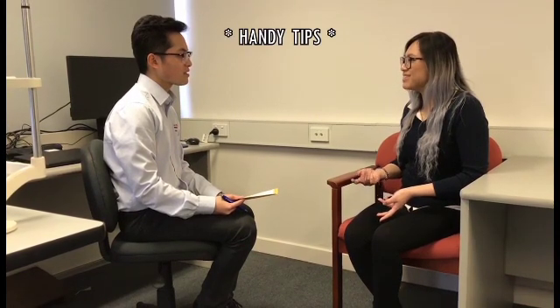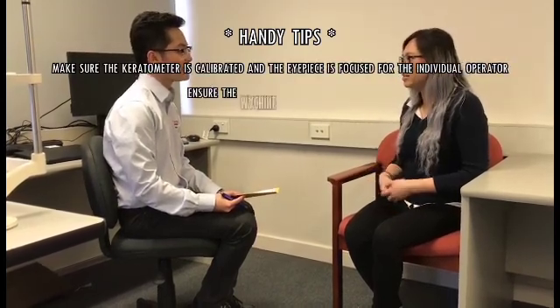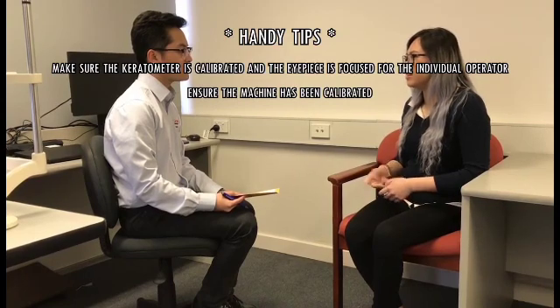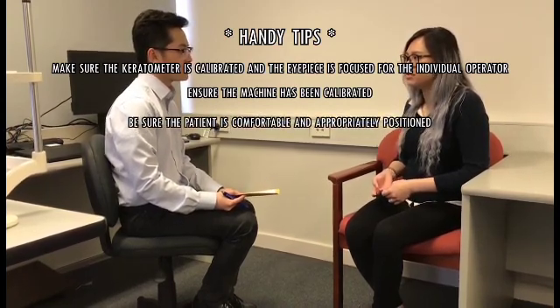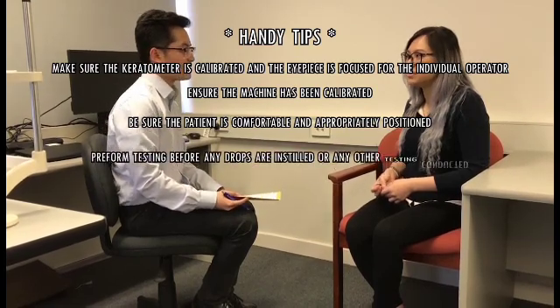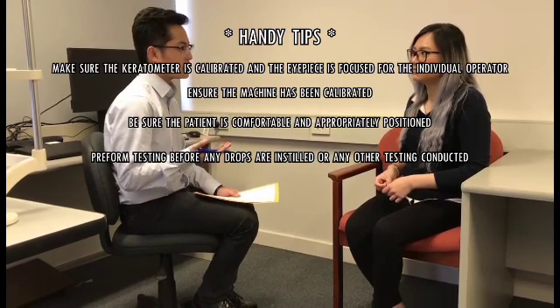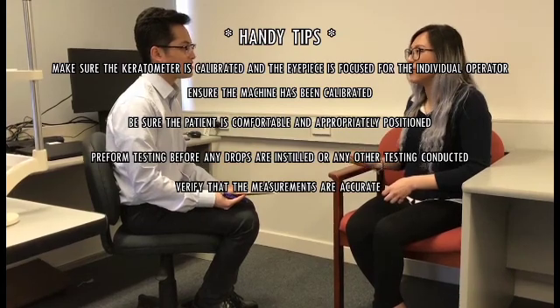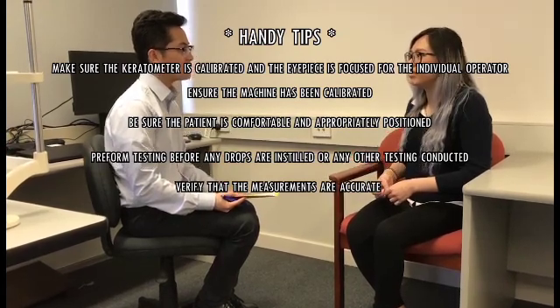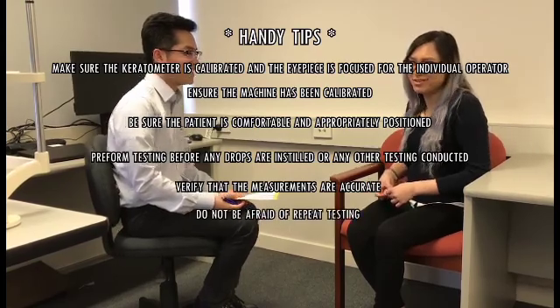Make sure the keratometer is calibrated and the eyepiece is focused for the individual operator before use, ensuring the accuracy of K readings. Ensure the patient is comfortable and appropriately positioned. Perform testing before any drops are instilled or any other testing is conducted. Verify that the measurements are accurate — you can do this by having another person double-check or by using a different type of equipment such as an automated keratometer. Do not be afraid of repeat testing.